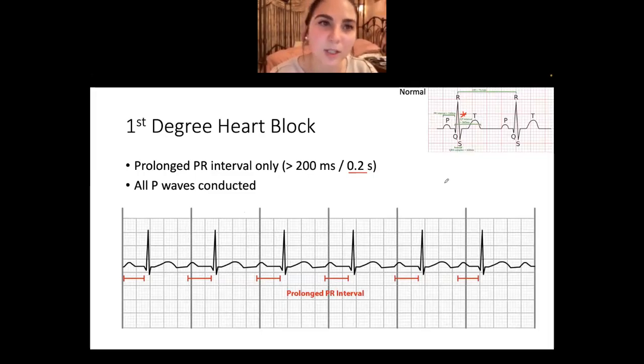So sometimes I'll see questions where a patient has a QT interval of 450, and then it would be like, oh, they have either a long QT syndrome or they're on a type 3 antiarrhythmic or a type 1A antiarrhythmic or something like that. So it's like, what is this patient predisposed to? Torsades. So just little things to keep in mind. I would just know that. I would know your PR interval is 160, and your QT interval is 360.